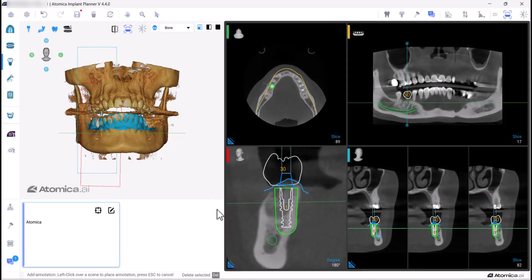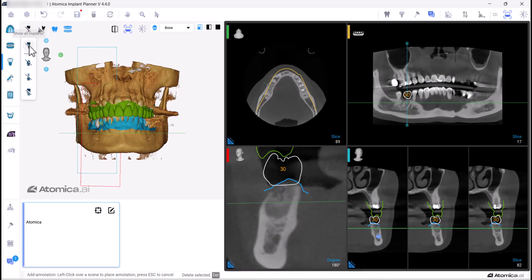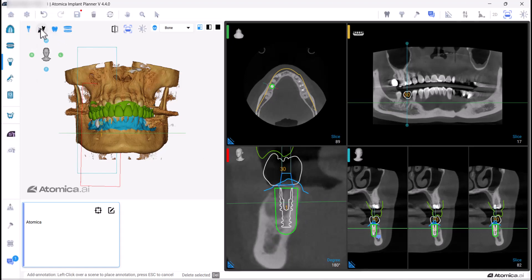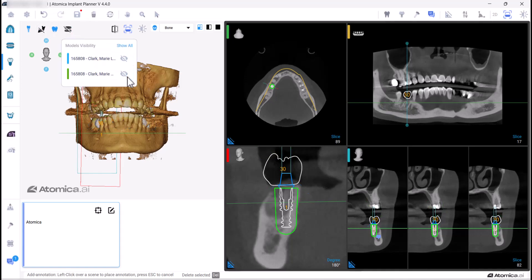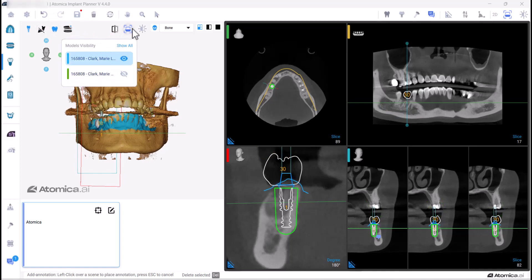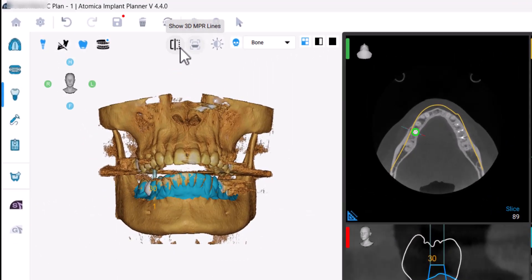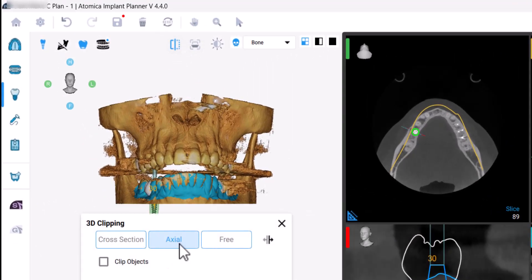While navigating through the 3D reconstructed model, you can hide any object by deactivating its icon. You can also hide models by making them invisible from the Models tab. You can clip the 3D volume from an axial, cross-sectional, and free direction.